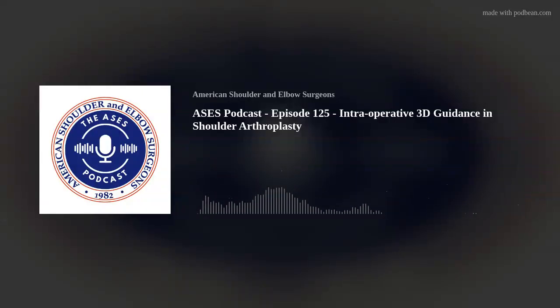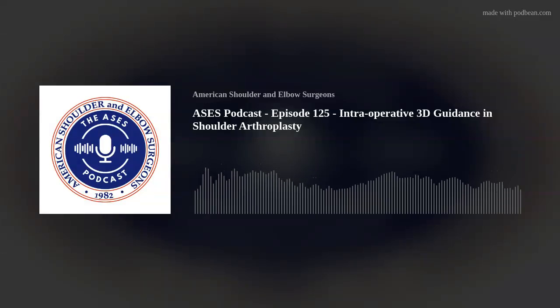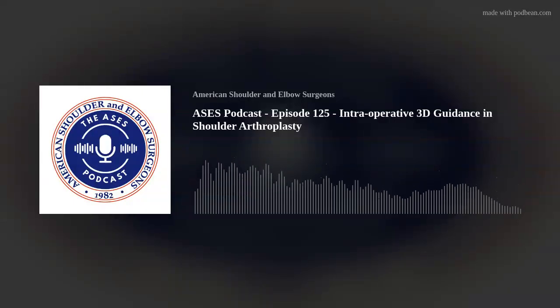is critical for that. As has been mentioned, we have all these targets in our mind, and then we go and execute, even if it's with PSI. Most people are not getting three-dimensional CT scans after their cases to confirm that those implants are in fact where they left them. We have good studies in cadavers and other models showing that they work, but we don't have a great study day to day probably replicating that.